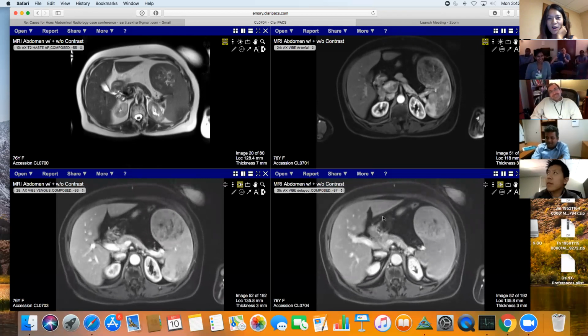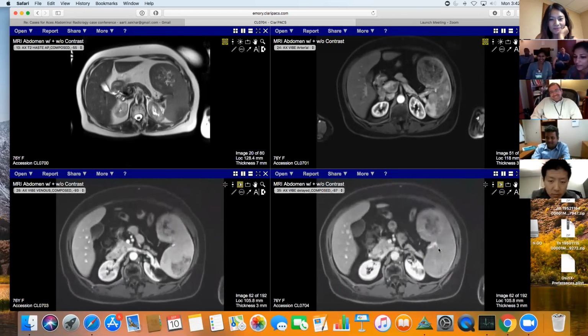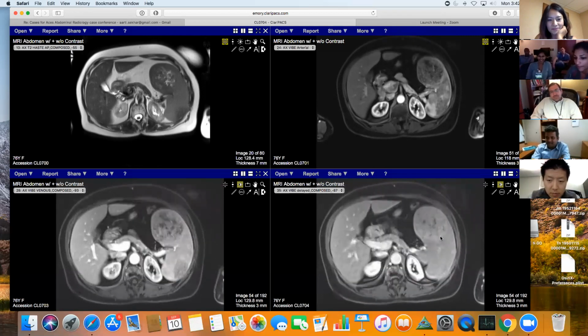I thought I would biopsy it. One of the reasons is that, especially when you have a focal mass, you're not actually biopsying the spleen, you're biopsying the mass. I could almost go into it without even going through much splenic tissue. I've done this a few times now, and the mass itself doesn't even bleed that much. This one has delayed enhancement. And I personally don't favor that this is an angiosarcoma, but I don't know what it is.